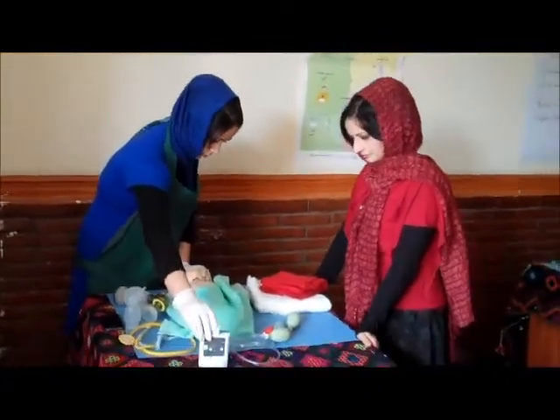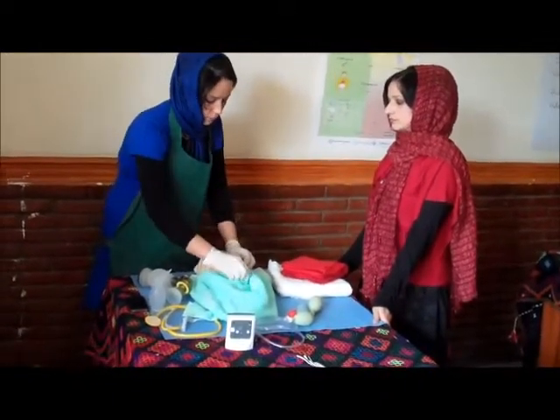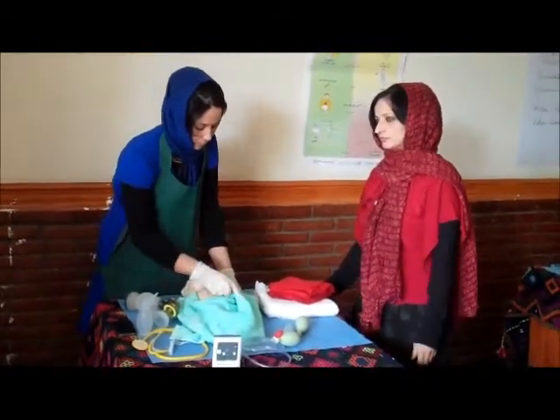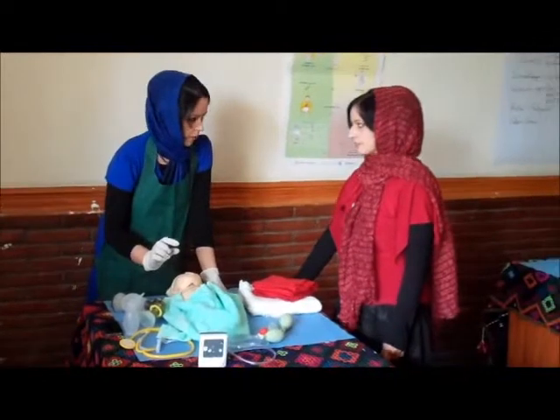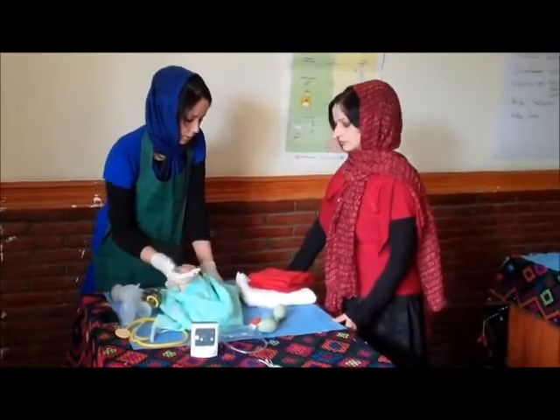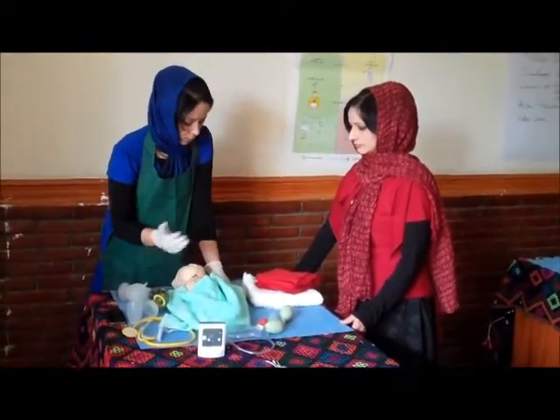We stop the watch — about 40 breaths in one minute. After that, we check the breathing of the baby. When the baby breathes, we monitor for five minutes. If the breathing is normal after five minutes, we do our routine check-ups and place the baby skin to skin with the mother.